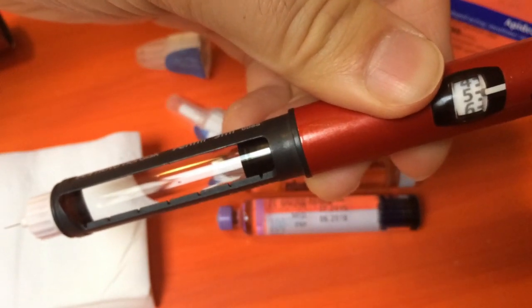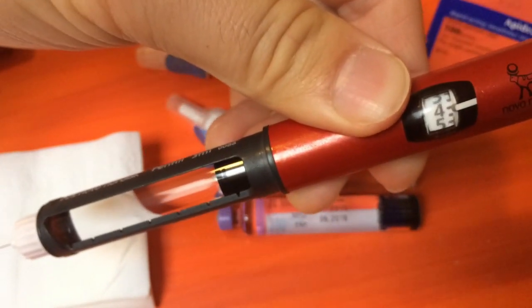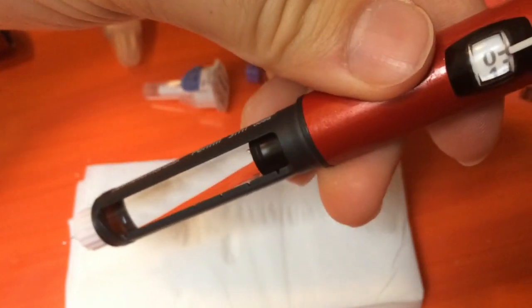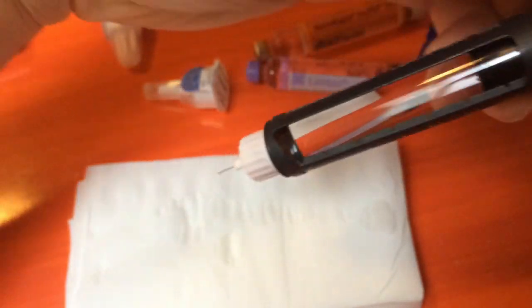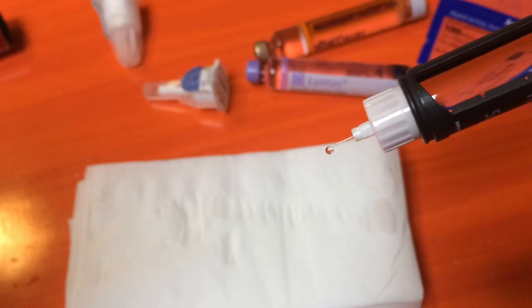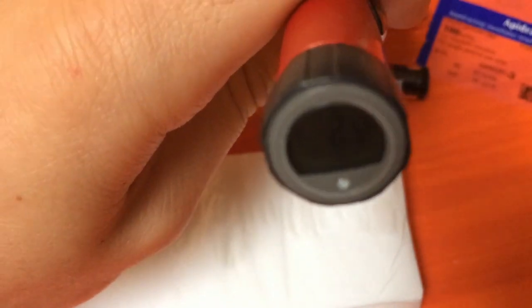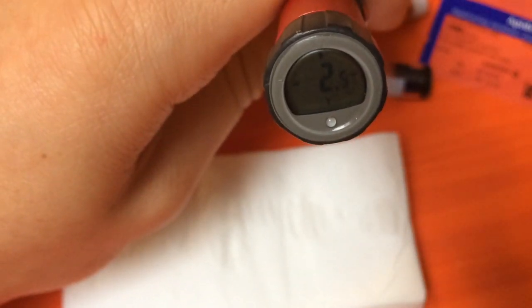Now we're going to prime it. Get the tissue in. There we are. As you can see, it's telling me two and a half units just put in.